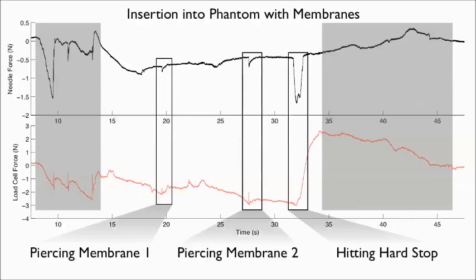The direction of forces is properly measured by the needle during piercing of the inner membranes. However, the load cell mainly sees increased inertial forces in these phases. The hard stop at the bottom of the phantom is truly felt by the needle, yet masked by the load cell measurement due to frictional forces along the needle sheath.